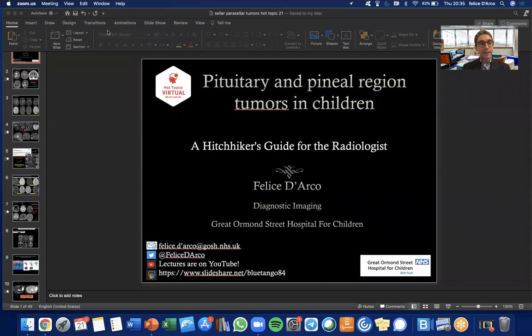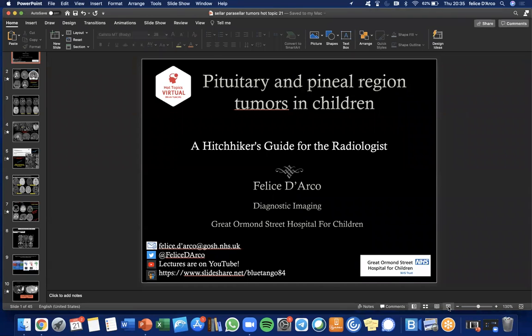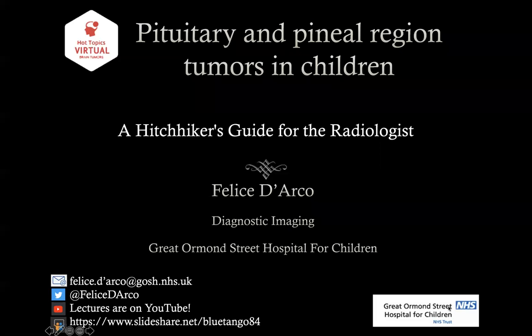While I share my screen, this lecture will be about pituitary and pineal region tumors in children. What I really would like to do is provide you with a guide for the differential diagnosis. I will give you some pearls and I will show you some pitfalls that really reflect what I do in everyday practice.